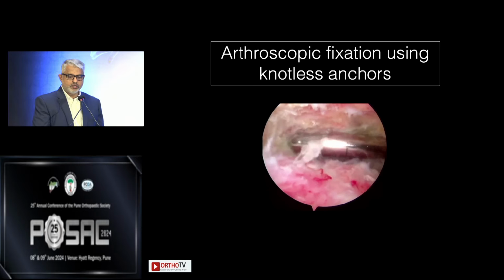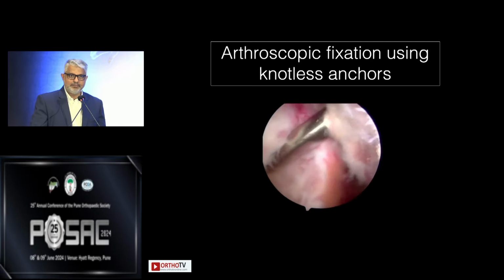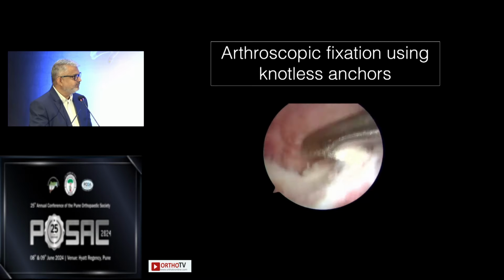You can also do a complete knotless fixation. That means medial 2 anchors using knotless devices. That is purely a tape type of construct. And this is, if patient is affording enough, that's my go-to device. So you can see that's the crater being cleared.